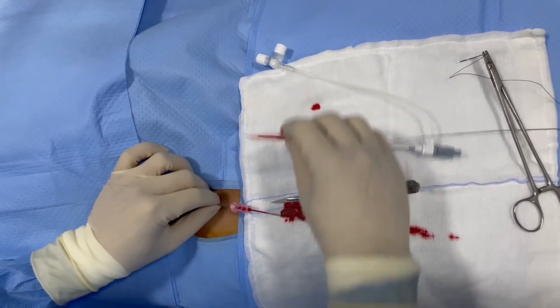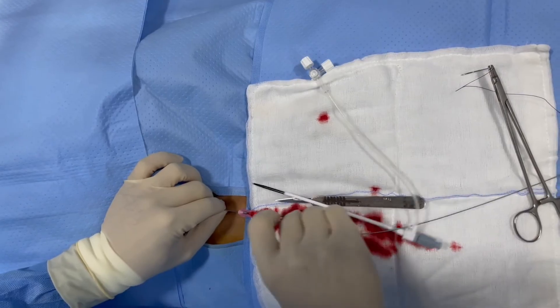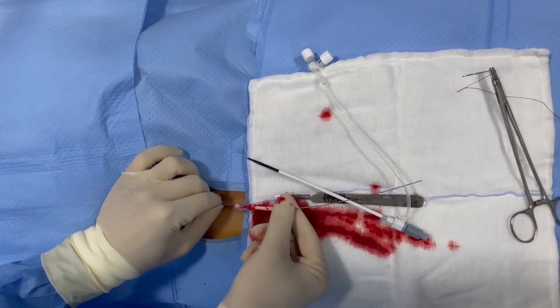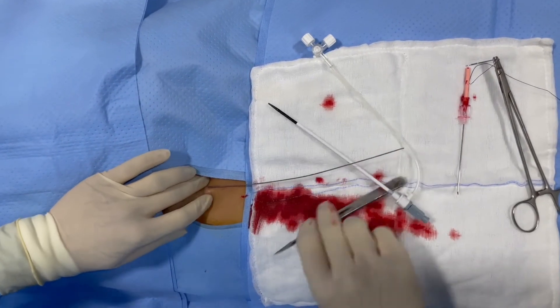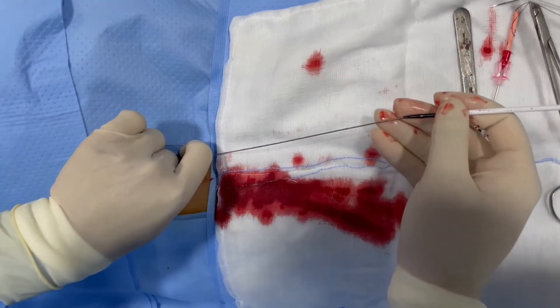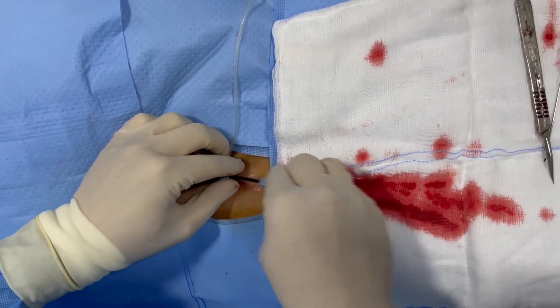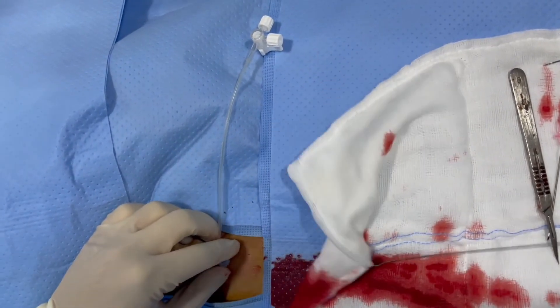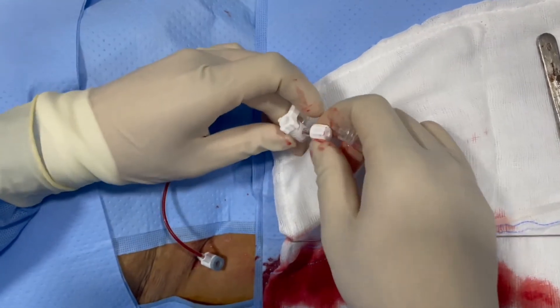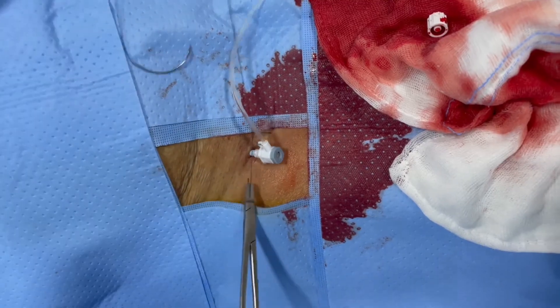Arterial puncture is confirmed by jet pulsatile flow of blood coming through the needle. Once there is free pulsatile blood flow, we stop advancing the needle and insert the J-wire through the needle. Once it is inside the artery without any resistance, we remove the needle, make a stab incision over the insertion site, and insert the femoral sheath with dilator. When the full length of the sheath is inside the artery, we remove the wire and dilator simultaneously, allow blood to come out through the side arm of the sheath, and then connect it with the flush system and secure it with the help of silk 2-0 cutting suture to the skin.